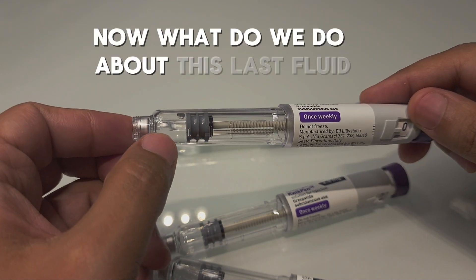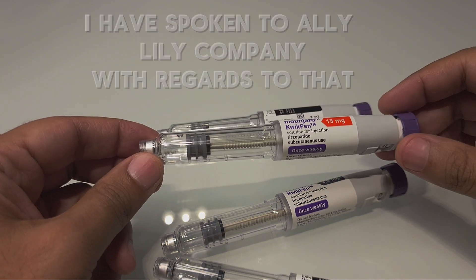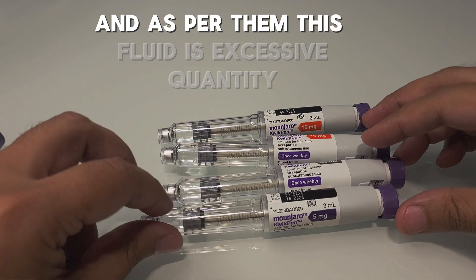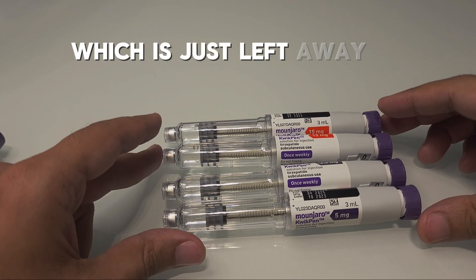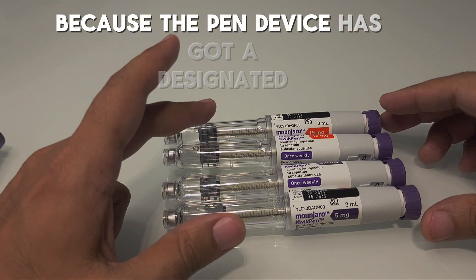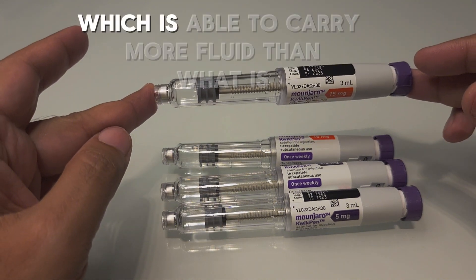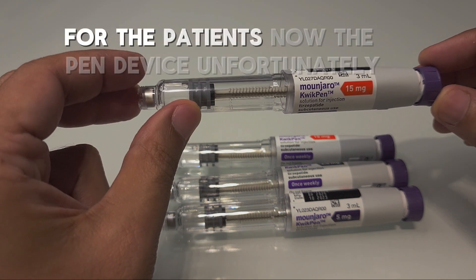Now, what do we do about this last fluid and why is it still left there? I have spoken to Eli Lilly company regarding that, and as per them, this fluid is an excessive quantity — a leftover — because the pen device has a designated glass compartment which is able to carry more fluid than what is necessary for the patients.